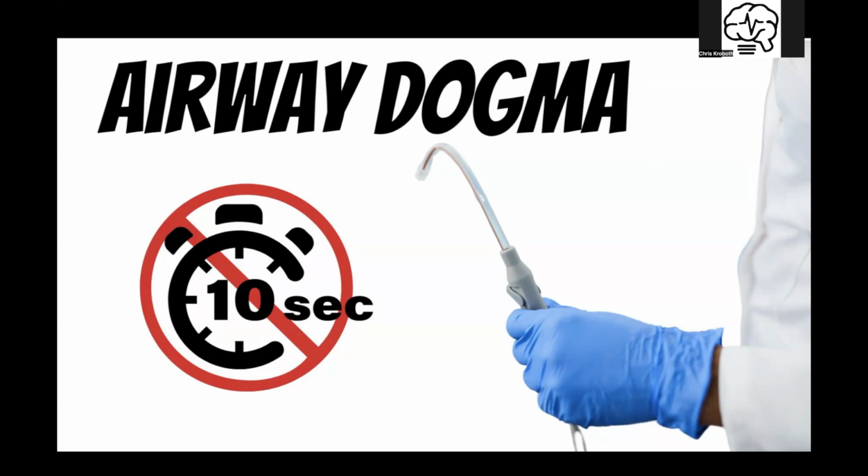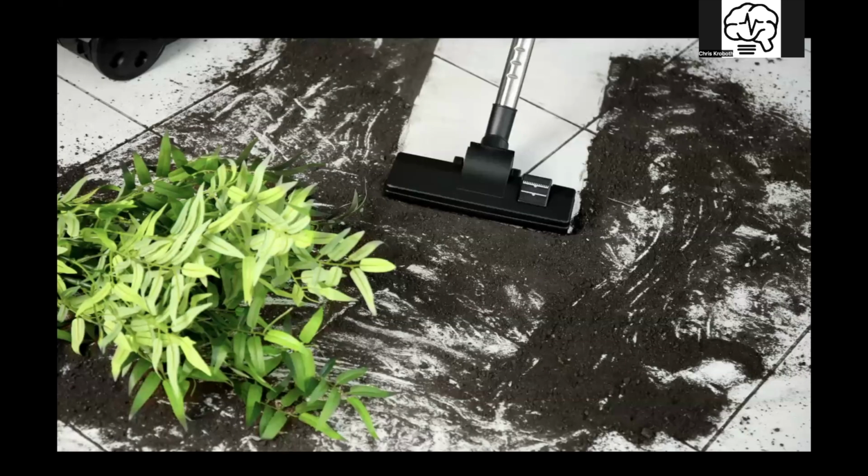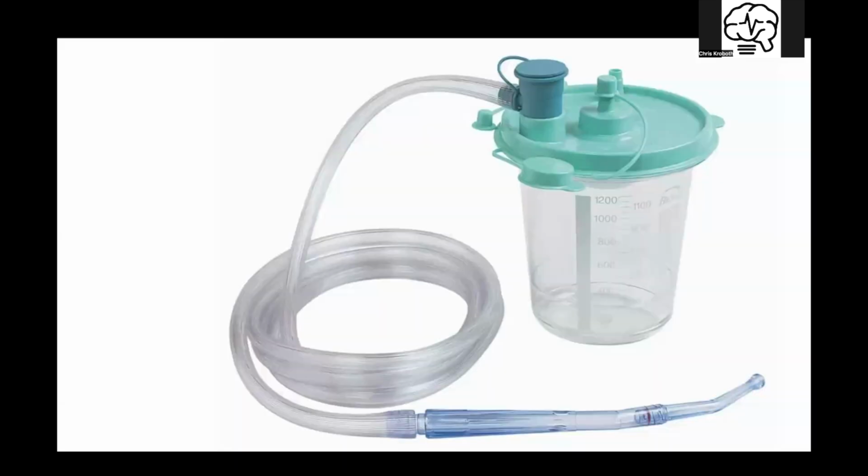No. If you allow the chunky nastiness to go into the trachea and become lodged and not allow gas to go past, that they will do. You don't vacuum your house in 10-second intervals, right? We don't suction airway in 10-second intervals.